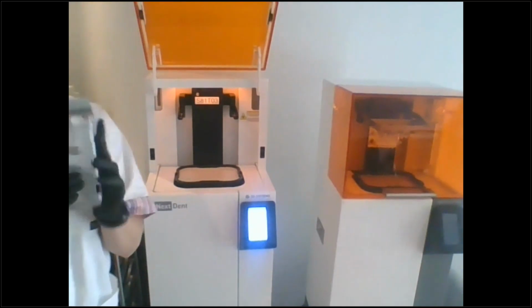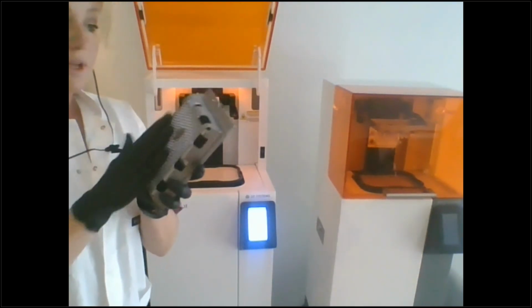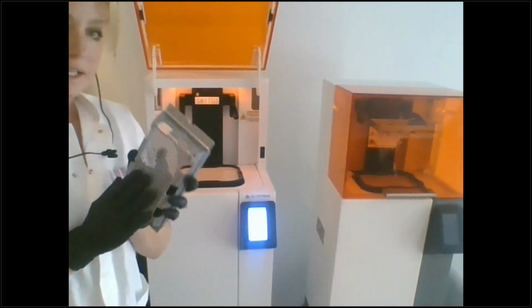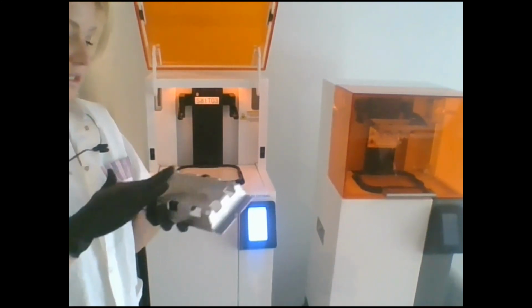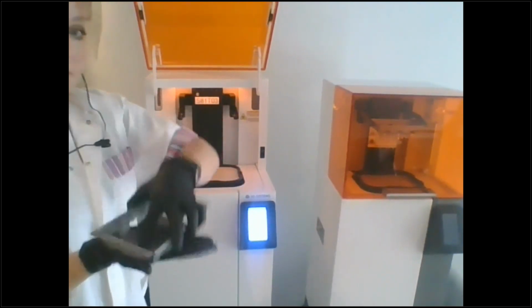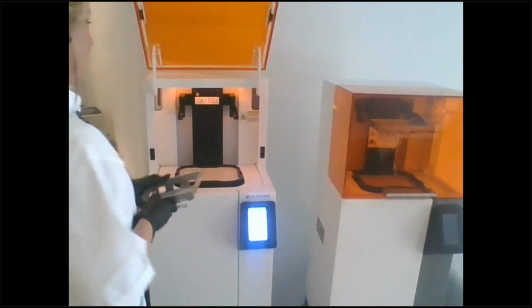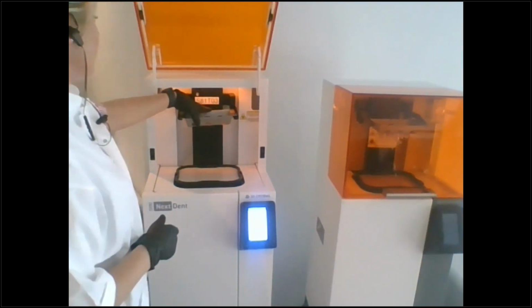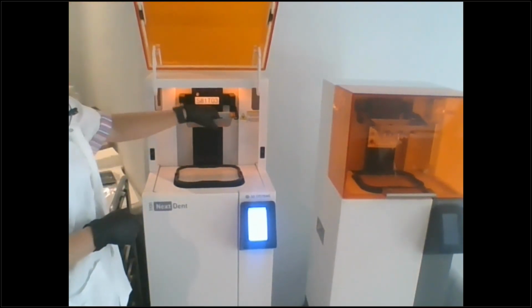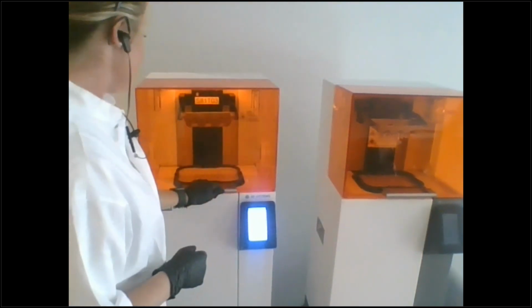And every time, if you're not the one that cleaned your plate, rub your glove over it and make sure there's nothing left on there. Make sure they cleaned it properly, okay? Because you don't want any extra residue on there, putting unnecessary force onto that membrane, okay? You want a nice, clean base layer here, okay? And it just goes on magnetic and it has little notches so it doesn't go on any different way, okay?